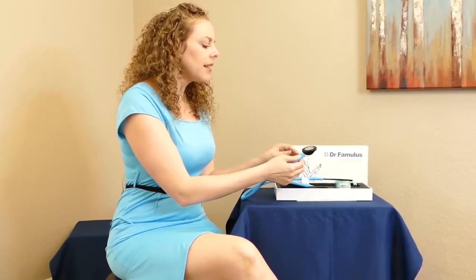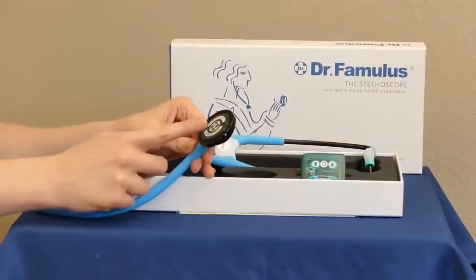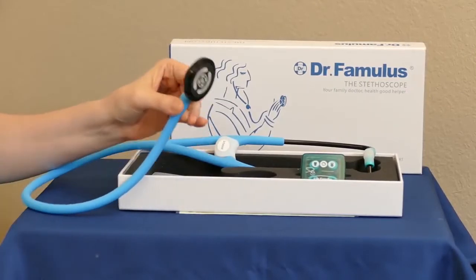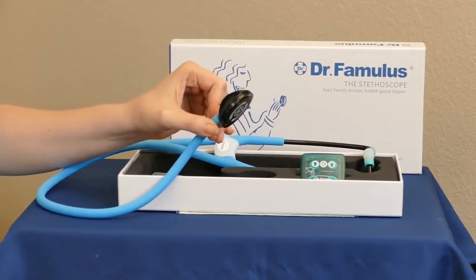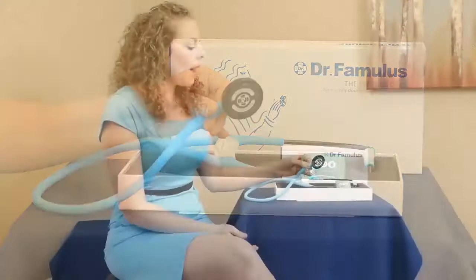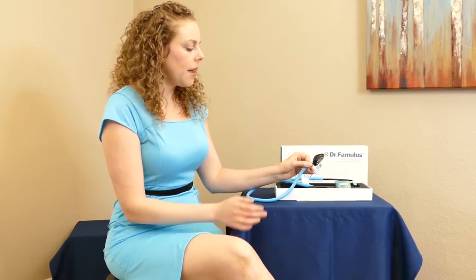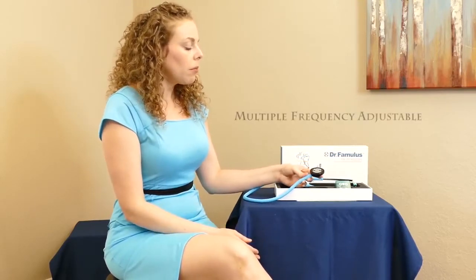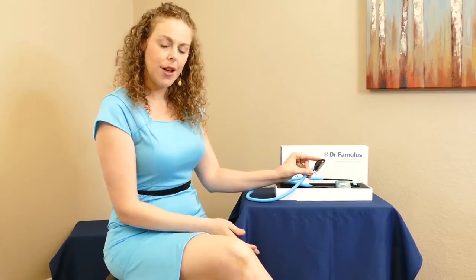A couple of the things that set this stethoscope apart from others is that it has this single chest piece. Typically there's a diaphragm and bell part of the stethoscope that you apply to the person's skin whether you're listening for their heartbeat or their breathing, but this one has combined both pieces into just one chest piece. It is still a multiple frequency adjustable stethoscope — simply by adjusting how much pressure you apply through the chest piece, you can move between low and high frequency sounds.